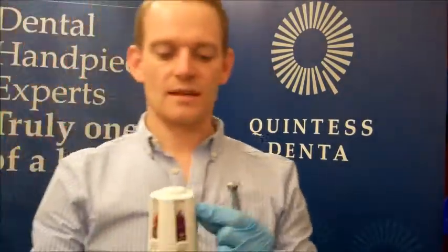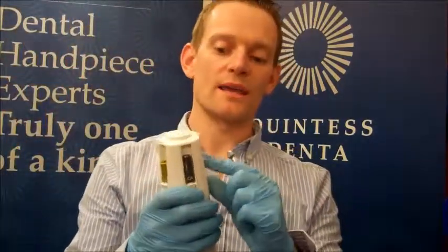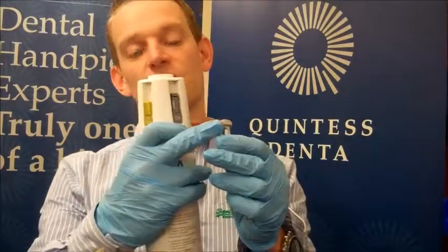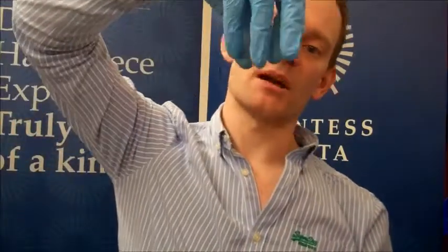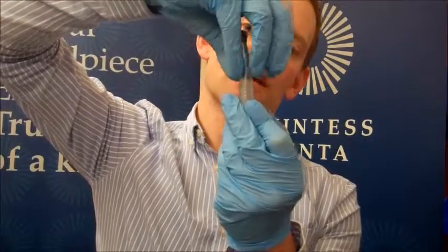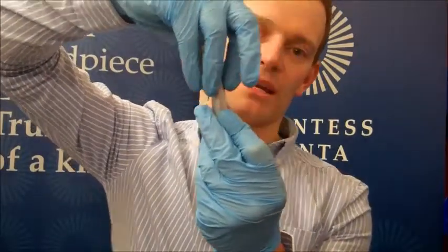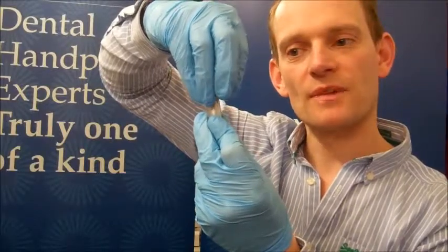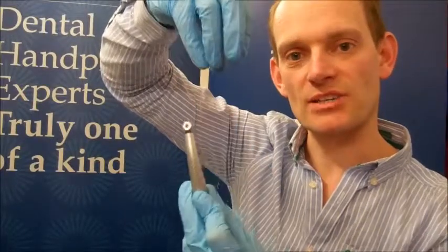So take the handpiece off the can of oil and just clean off any excess oil there. Next, once per week you should be oiling the chucking mechanism where the burr enters. Now the idea of this is, if you imagine that's your chucking mechanism and the handpiece represents the burr, if we get any dirt or debris stuck between any of these jaws, it's not going to be able to grip the burr very tightly, and you've lack of burr retention.